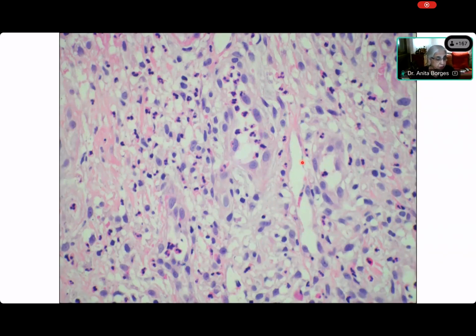Now, I want to ask somebody over there, Kedar, what are you seeing in this particular blood vessel? You can see a blood vessel, right? Kedar? Has Kedar disappeared? Oh, Kedar is not there. Sorry, ma'am, I was muted. Oh, sorry. Okay. Kedar, what are you seeing in this blood vessel? Inside the lumen of the central blood vessel, I can see neutrophils.